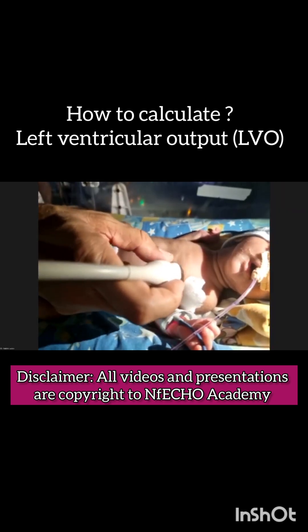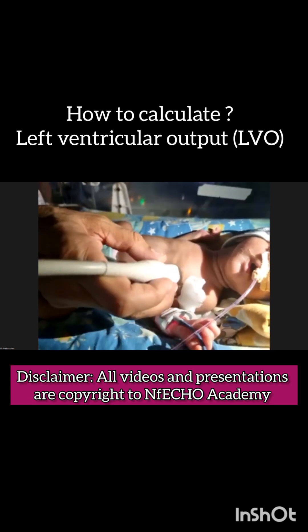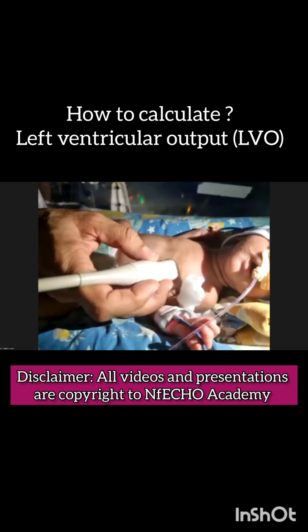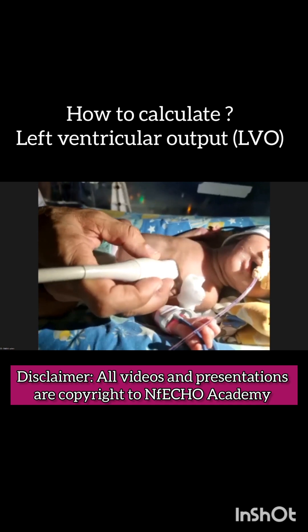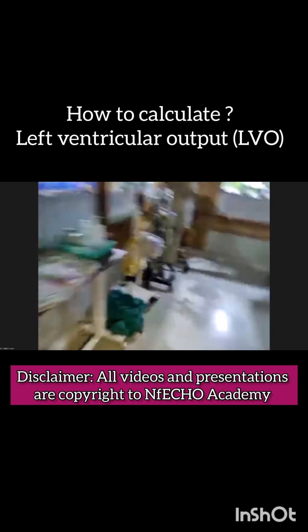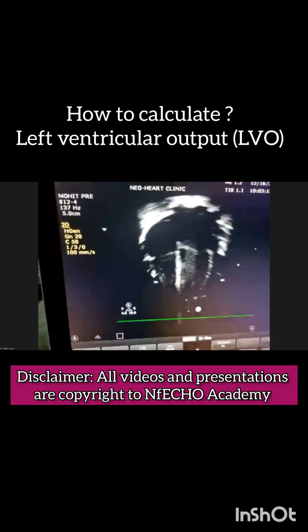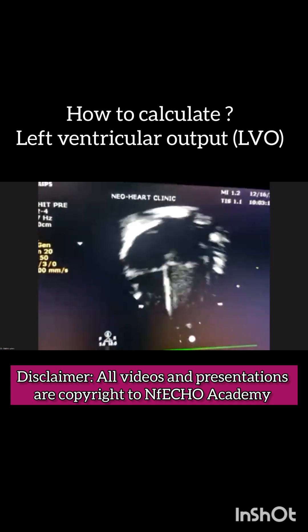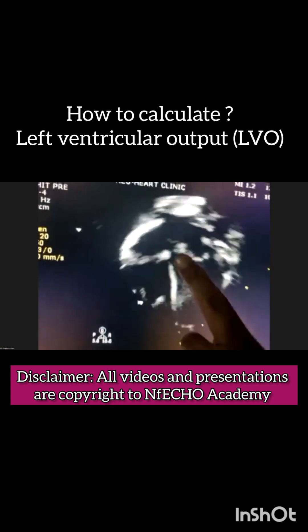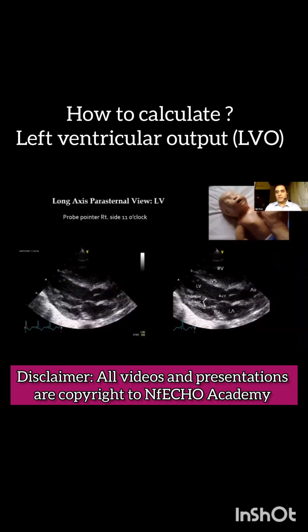As you can see in this video, the probe is kept on the baby at the apical window with the pointer pointing at 3 o'clock, meaning the foot of the probe is being swept upwards, that is anteriorly. On the echo screen you are seeing the apical four chamber view, and as the probe is swept upwards anteriorly, the fifth chamber — that is the aorta — is being opened up. We can then keep the pulse wave Doppler in the aorta just above the aortic valve.